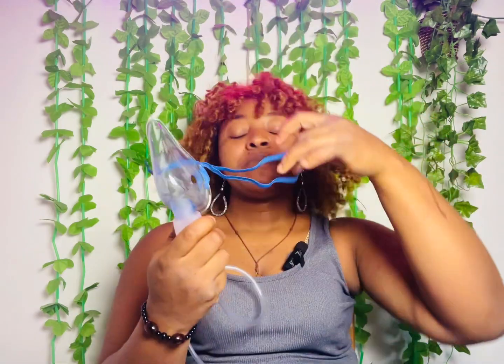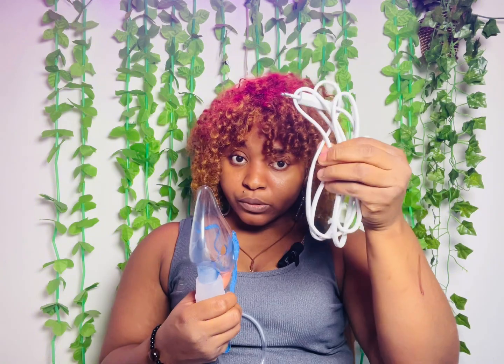So for you to hear me better, I'm going to take it off, but that's how you're supposed to do it. And then you're going to take the plug and put it over here where you see this. You put the plug in, and that's just it. That's how you use your aerosol. Now this machine, like I said, comes with both adult and kids accessories. So for example, I'm using the adult one, which means I have extra that my child can use.